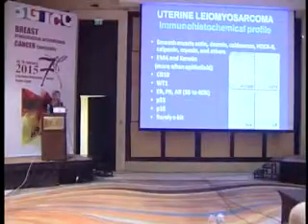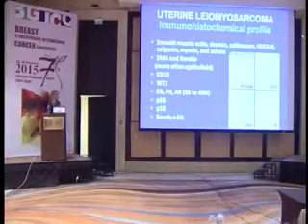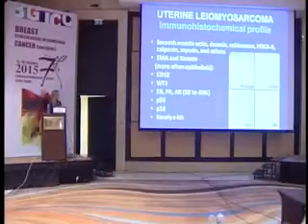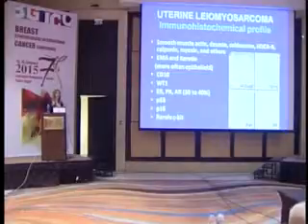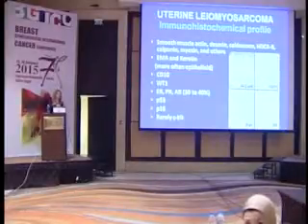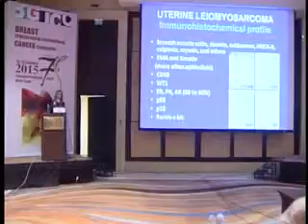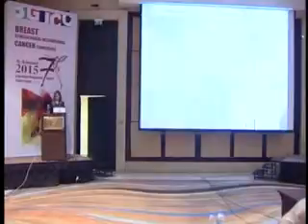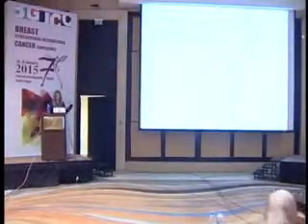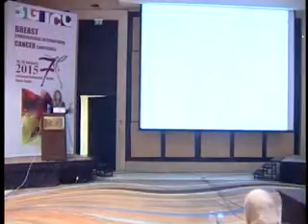Immunohistochemistry is very debatable in the literature. EMA and keratin, CD10, WT1, ER, PR, AR, P53, P16. Honestly, what I do is caldesmon, H-caldesmon, actin, and sometimes my differential diagnosis is cellular leiomyoma, not leiomyosarcoma. Think about endometrial stromal cell tumor, okay? And so caldesmon, leiomyosarcoma, and CD10 might be three of them, both positive.